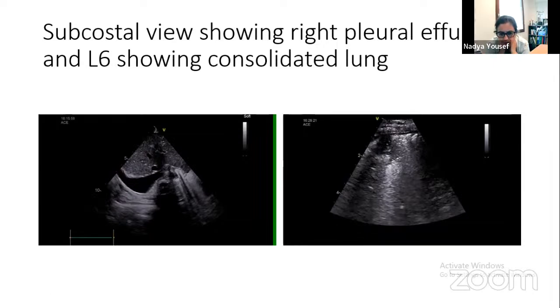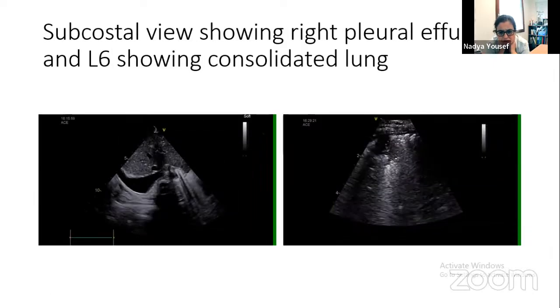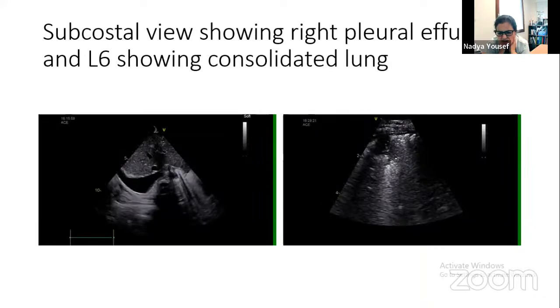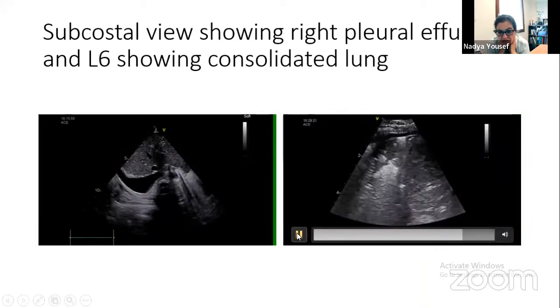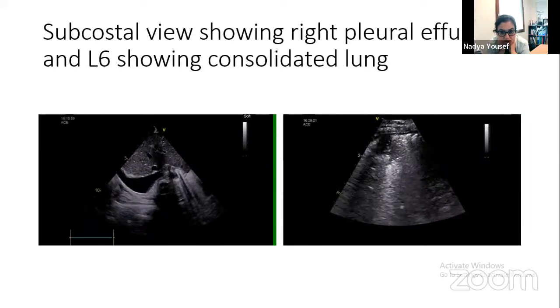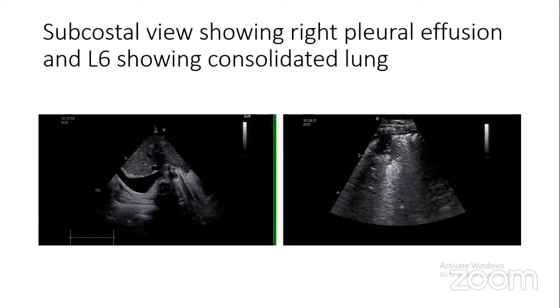Bilateral pleural effusion with multiple consolidations, it would be interesting to see how that goes, but it's very strange. I agree that CRP levels are not elevated, so maybe it's, I don't know. And the baby is doing well now after the effusion has been tapped and the lungs have been re-expanded. Maybe after a few days I will repeat the ultrasound and see. Clinically, the baby has significant improvement after tapping, and the antibiotics were also revised to more potent antibiotics. He's on meropenem right now.